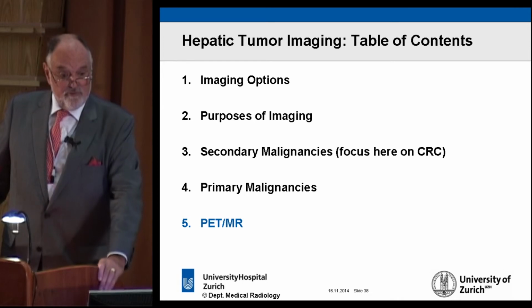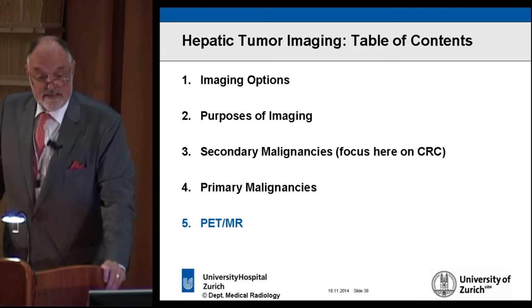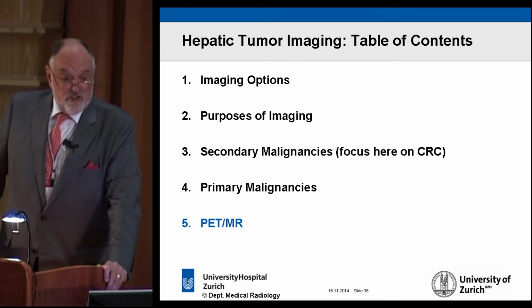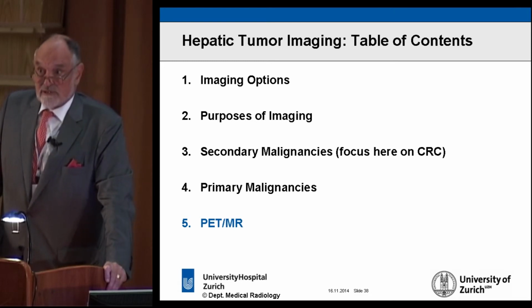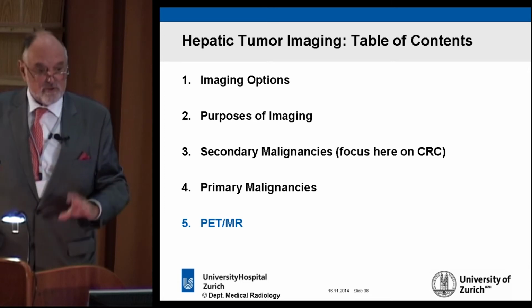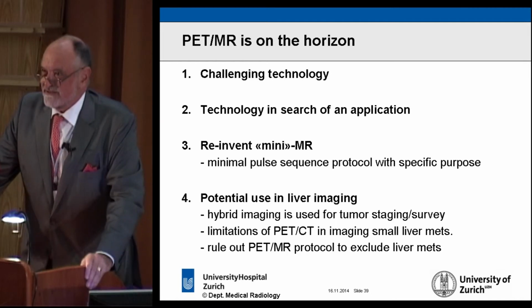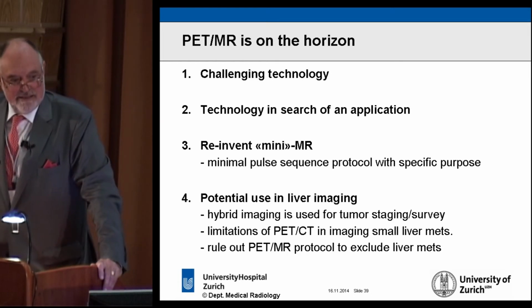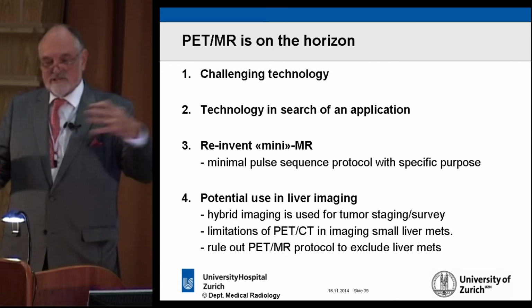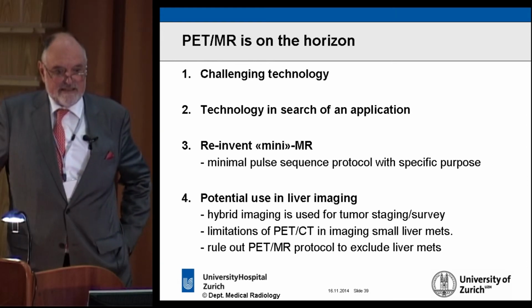We have been lucky enough to play with this technology for the last 3 years. The conclusion is this is a very challenging technology because PET and MR don't like each other, so you have a lot of technical issues, and I don't want to belabor those, but please understand PET-CT is like brother and sister, and PET and MR is like the devil and God or something like that. You have to do a lot of technological changes to get this together.